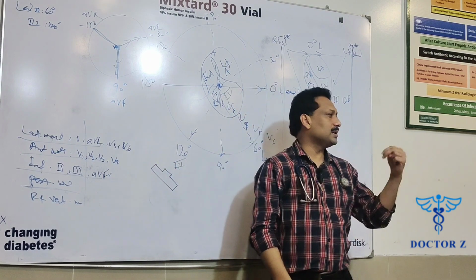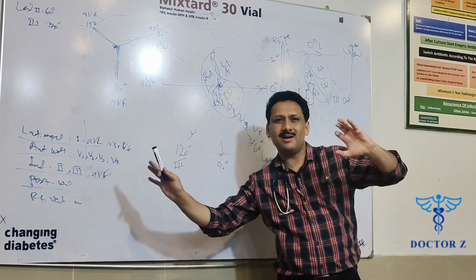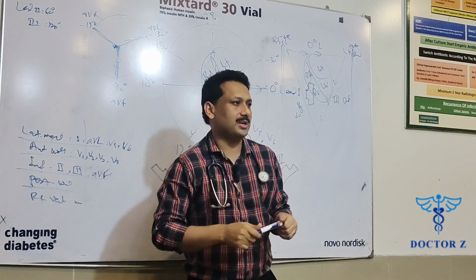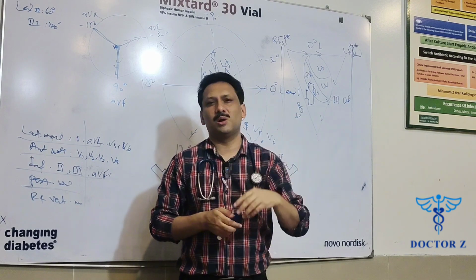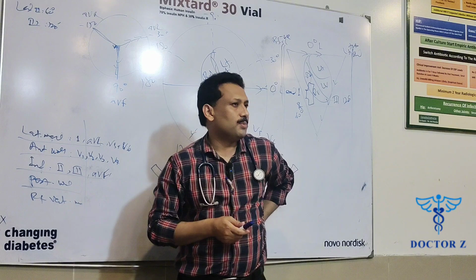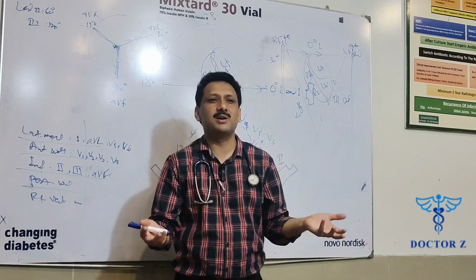What next? Two walls are left. And if you have learned the camera thing up till now, if somebody asks you this simple question, that now you need to look for the changes in the posterior wall, whatever is happening, so should we place the cameras posteriorly? Because this is clear that cameras see whatever is in front of them.